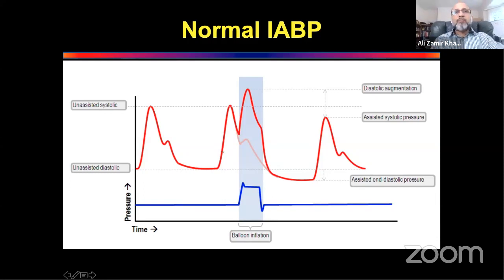That is why most people draw this and they stop. Whenever in the exam I've asked people to draw balloon pump, most people draw this normal and they draw this augmentation and stop. And I'm sure today a lot of you did that. You just drew this augmentation for me and stopped. But that is not where the balloon pump stops. The balloon pump benefit continues into diastole, and you have to draw the next cycle where there is severe reduction in the end diastolic pressure in the aorta.